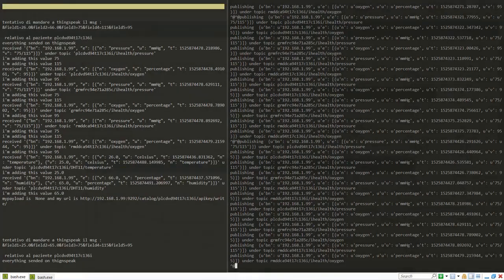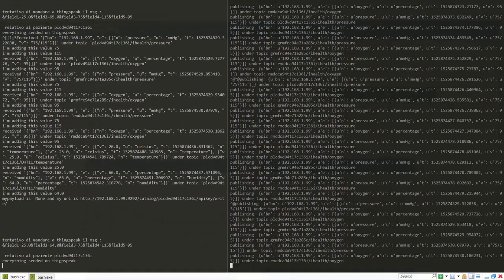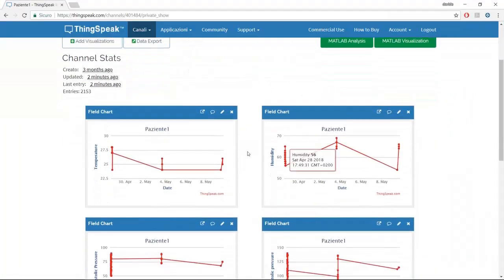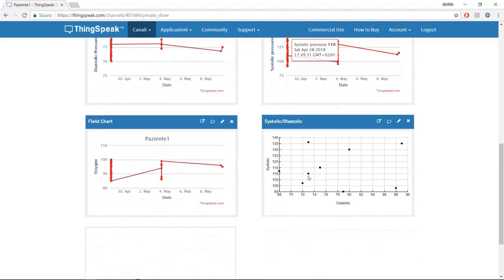Now that we have all the resources, the ThingSpeak adapter can receive them, and the resources are related to the fields of the ThingSpeak platform. Each time that all the resources are present, they are sent to the ThingSpeak platform. So, for patient 1, for example, we have a chart for temperature, humidity, diastolic pressure and systolic pressure, oxygen, and then a chart that makes a comparison between diastolic and systolic pressure.